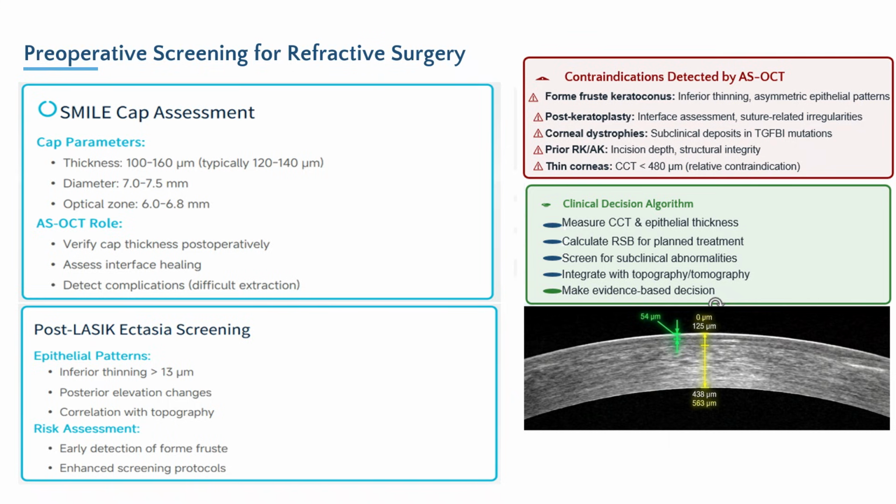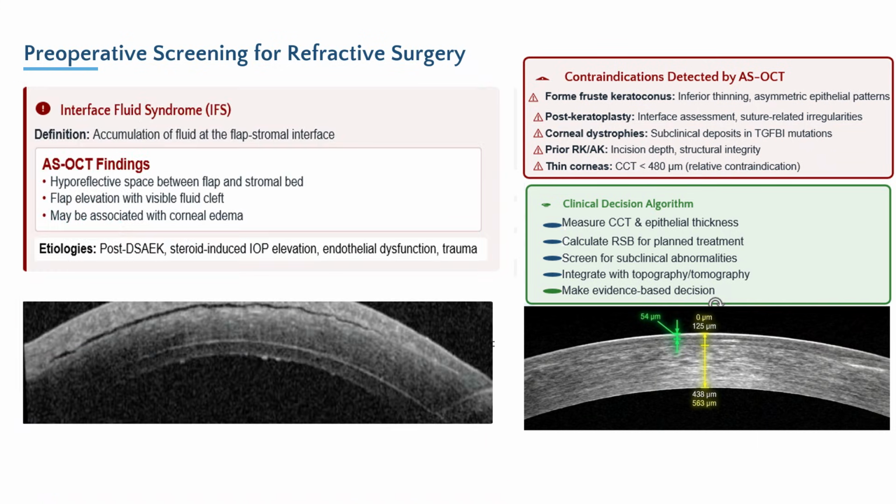And among the assessments, also postoperatively, we have to determine the risk of postoperative ectasia after doing the surgery, because even if you take your utmost precautions, you don't know, some cases might be missed, and the patient may be at risk of post-LASIK ectasia. And if we detect them early, we can manage them very early and avoid significant complications.